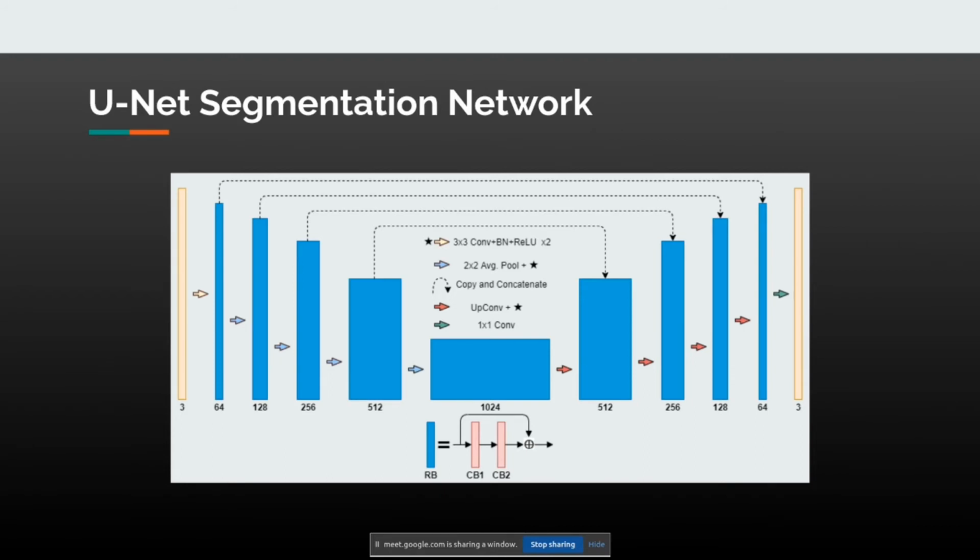Our network, on the other hand, uses a specific type of CNN called UNet, that is primarily used for biomedical image segmentation. The main reason why it's called UNet is that it's shaped like the letter U, and as the image passes through the convolutional layers of UNet, the features in each color channel get more emphasized.